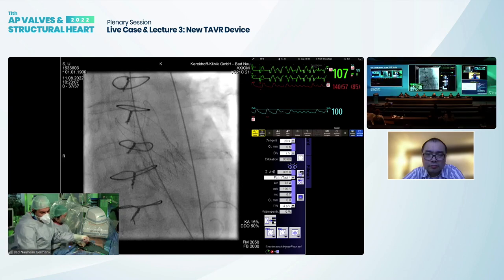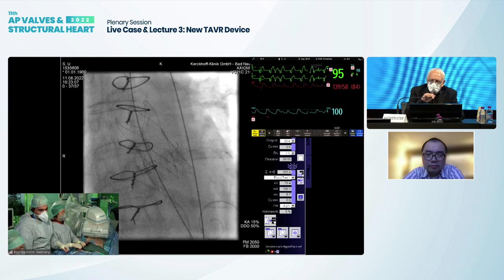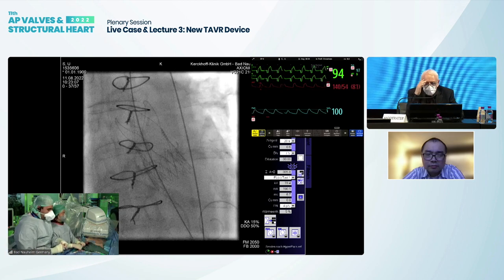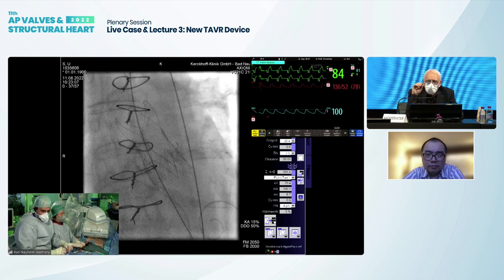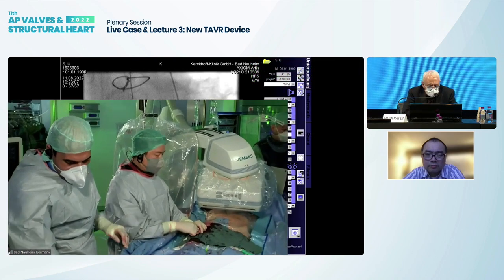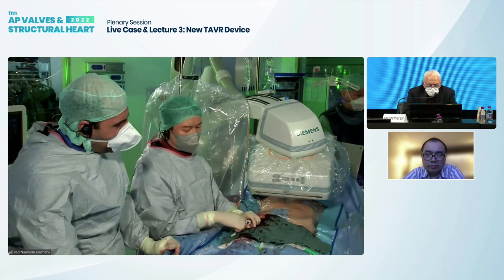So it's a forward motion. When you saw the rapid turn of the wheel, then you have to do it quick, and there's a slight forward push of the valve. Correct? Yeah, this is correct. And you need a first operator.